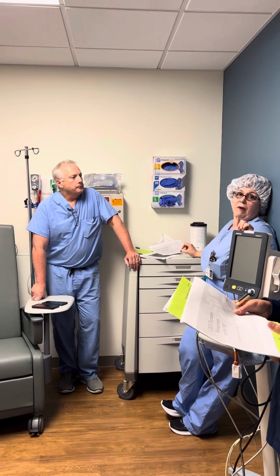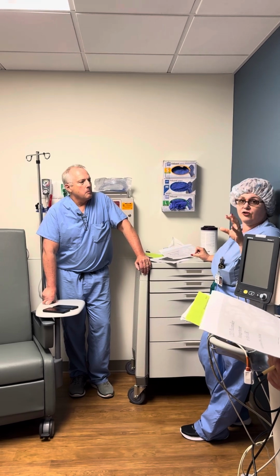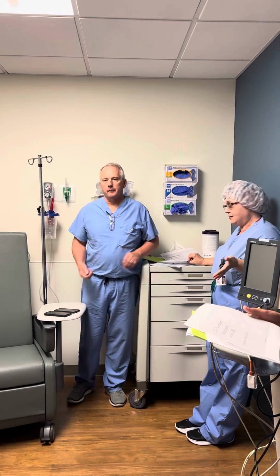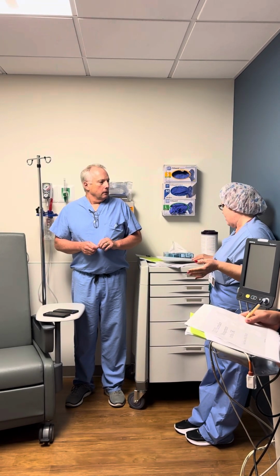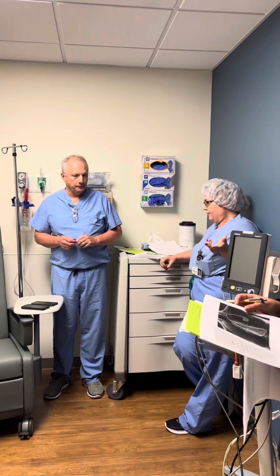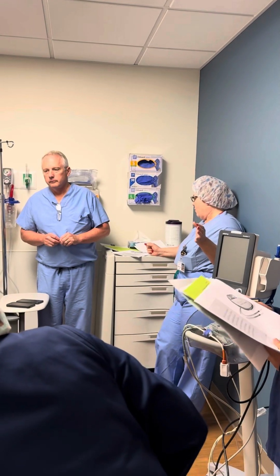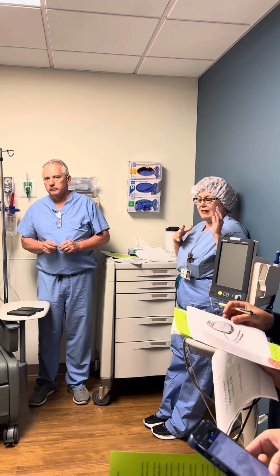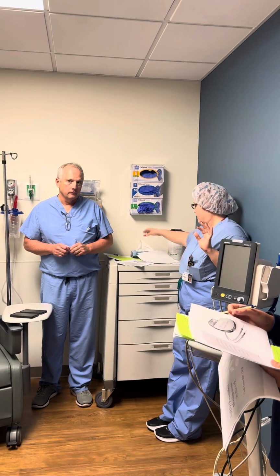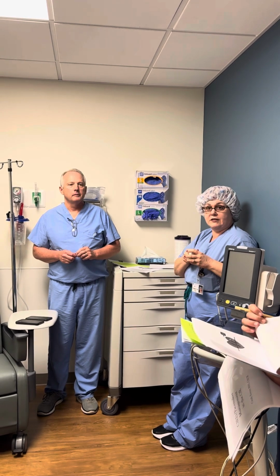ICD, but currently our policy says CIED, which is cardiac implanted electronic device. Okay, so I wanted to just go over what our policy says along with following the AORN standards. Here, we want to make sure that we're doing patients that are obviously suitable for an ambulatory surgery center. We want to minimize the electromagnetic interference and manage the patient with either the use of a magnet or reprogramming if necessary.